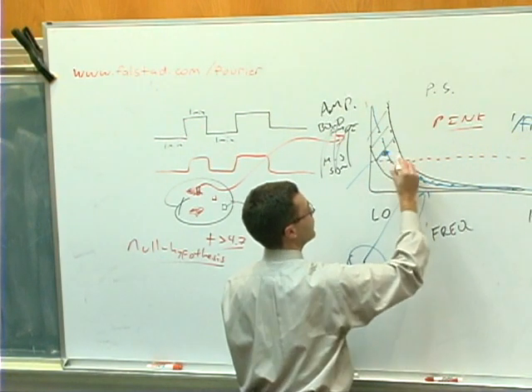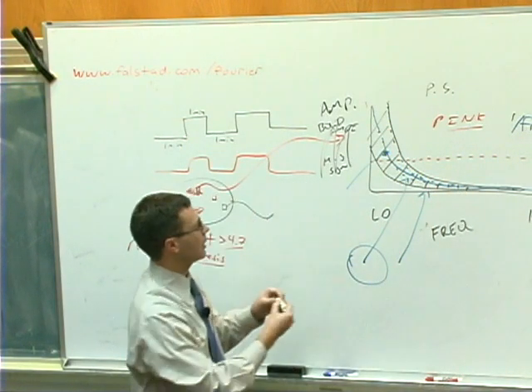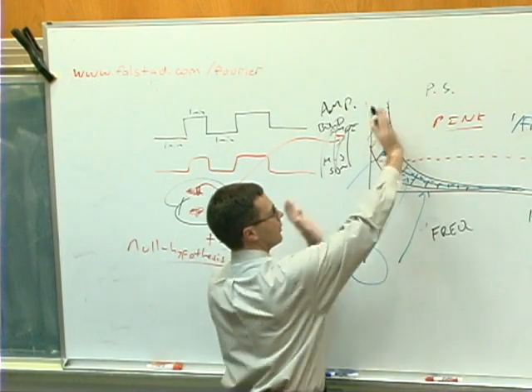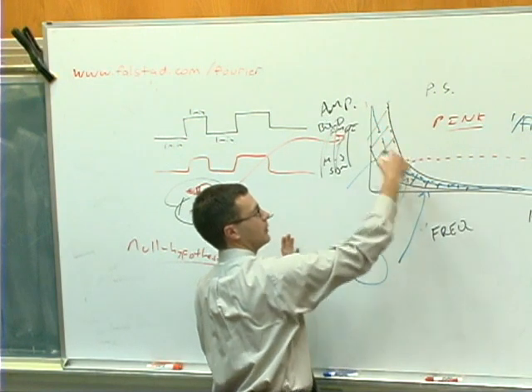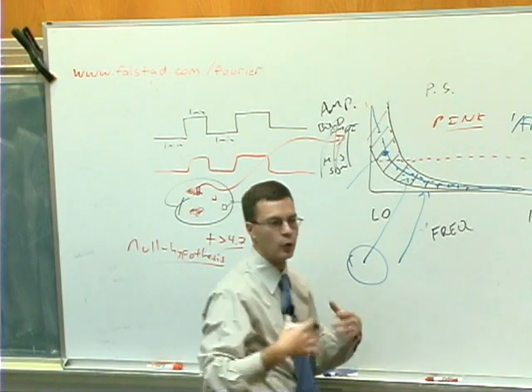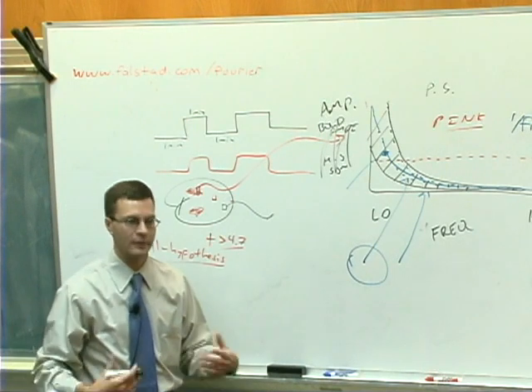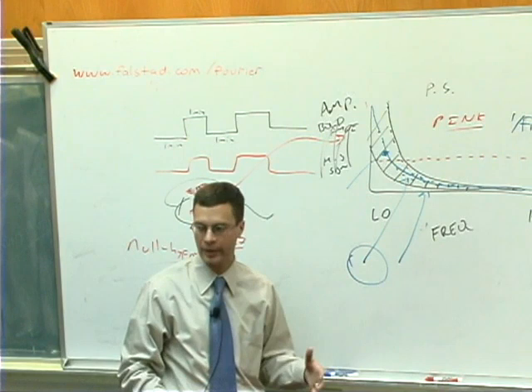So the 1 over f frequency actually looks more like this. That is, there's a greater and greater spread. In fact, it's even more dramatic than I've drawn here. But there's a greater and greater spread of different possible curves at low frequencies as compared to high frequencies. So the amount of low frequency noise is very variable at the low frequencies. Luckily, at the higher frequencies, it's a little bit more consistent. But at low frequencies, it's very variable.